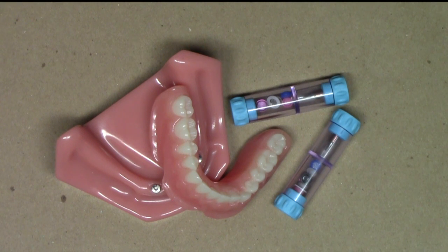Hello, this is Dr. Michael Scheer with Learn Locator, a free resource on how to treatment plan, utilize, and maintain locator and locator RTX attachments for overdentures. In this demonstration video, I'm going to be describing my same-day locator laboratory reline protocol that I use in my clinical practice.